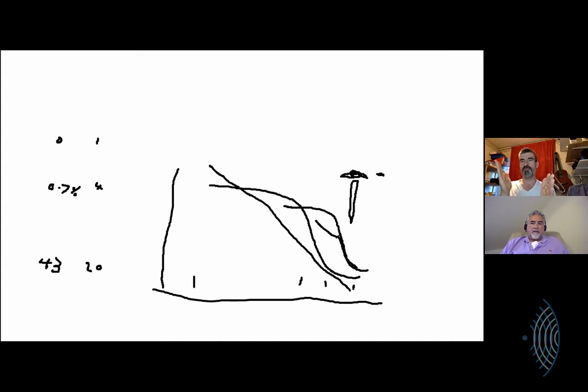The best reflectors in the soft tissues are less than 1% of reflection. Bone reflects at over 40%. You don't need any differentiation between 1% and 40%, whereas you need lots of subtle differences between 0.4% and 0.8%. So you make that where the biggest change in your picture is.